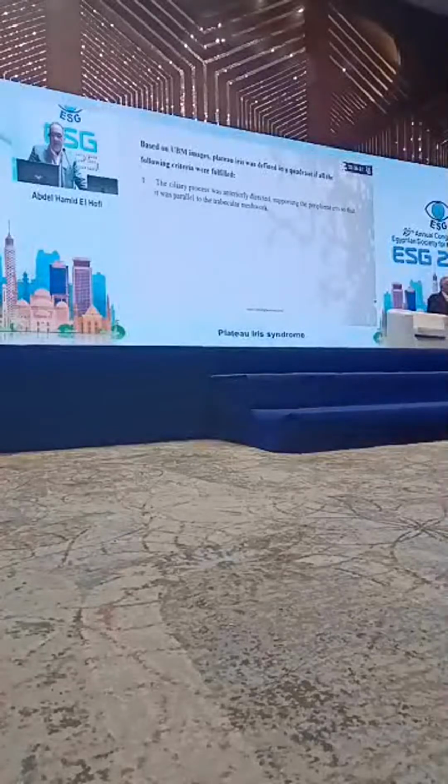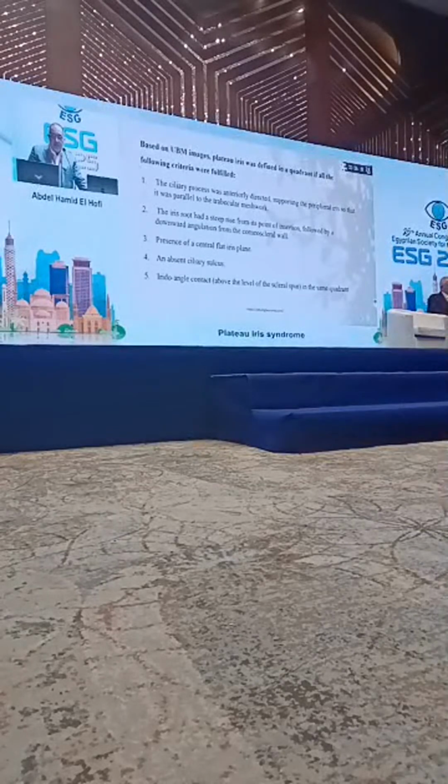Based on UBM images, we have 5 criteria which might be present in a single quadrant, or 2, 3 or 4 quadrants.